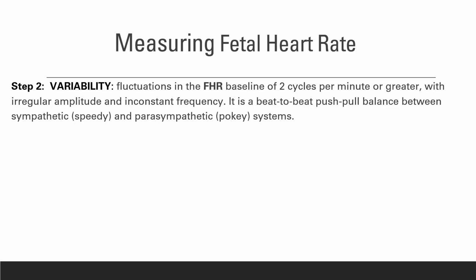First and foremost, you want to establish the baseline. Just like adults, we all have different baselines. Same with the fetus. Usually if they are early in their fetal gestation, they're more tachycardic. As they become term, they start to normalize in the 110s, and again, every baby has a different baseline. So first and foremost, you want to be able to establish your baseline.